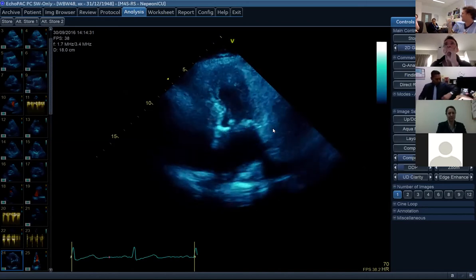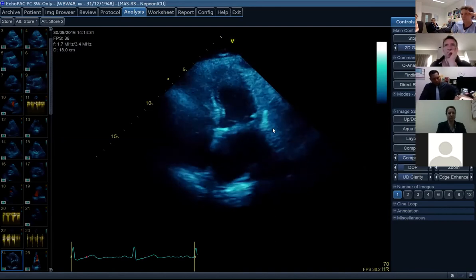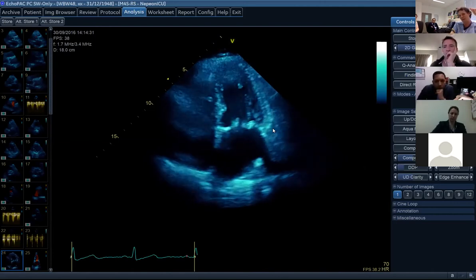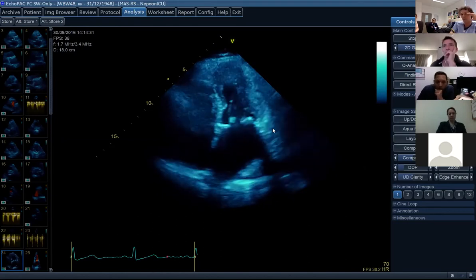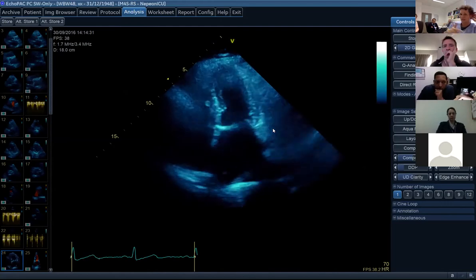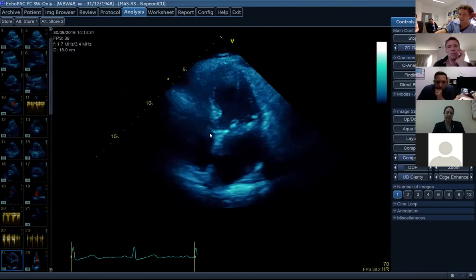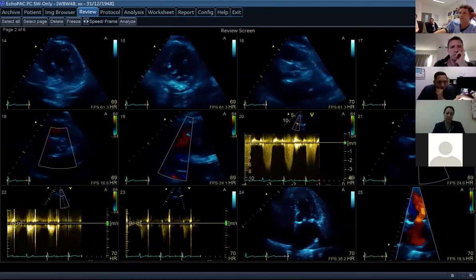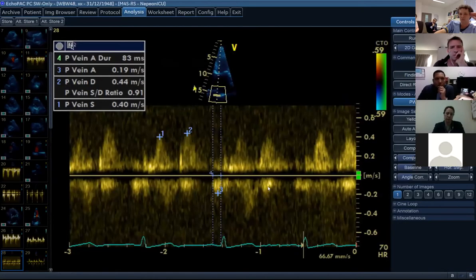And mitral annular calcification, when it's significant, is a bit of a bugger when you're starting to try and assess the E wave. Looking at the tissue Doppler, things like the E prime and the E to A ratio, sometimes you've got to be a bit careful. That's why we're going to use what Arnie was talking about: looking at our left atrial size, the interatrial septum, and the pulmonary vein flows, such as Lee was describing here.